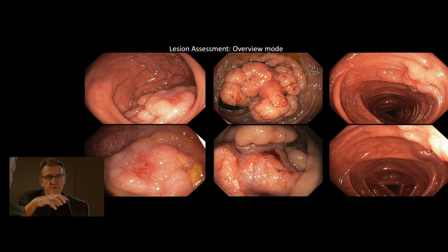If it's a nodular lesion, just to make this important distinction: in flat lesions, the surface expression of cancer will usually be visible. We've shown in a study of 2,500 cases that the sensitivity of endoscopic detection of invasive cancer is reliant on morphology. If the lesion's flat, the sensitivity is 95%, specificity 95%, and the risk that you'll miss cancer in a flat lesion is 6 in 1,000 cases.